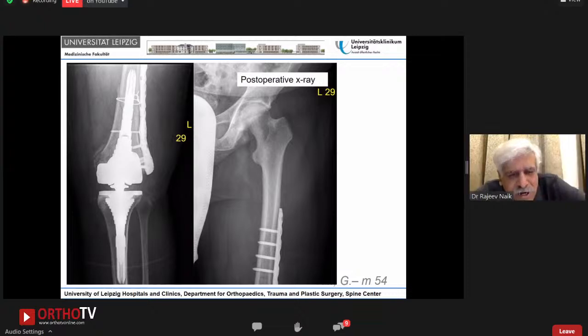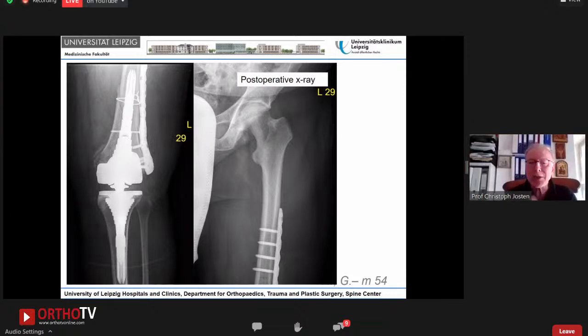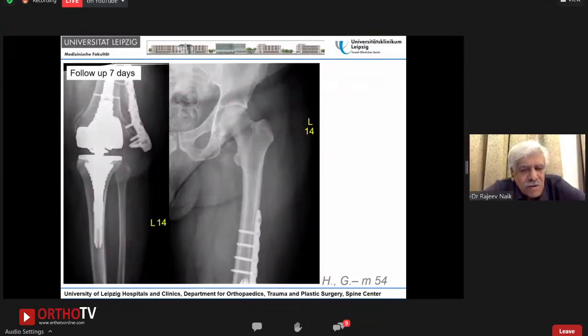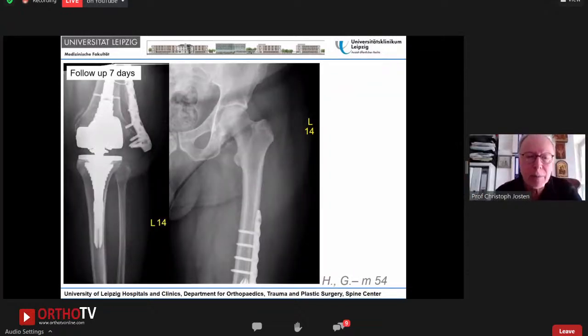Yes, we see an X-ray of a joint replacement and a periprosthetic fracture. Yes, this is correct. This is a periprosthetic fracture which has been treated by a plate. And I go ahead. This is a follow-up 7 days later. You see, there was a loosening of the screws. What would you do now?